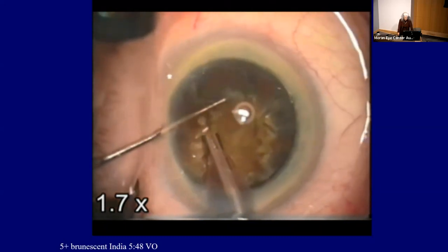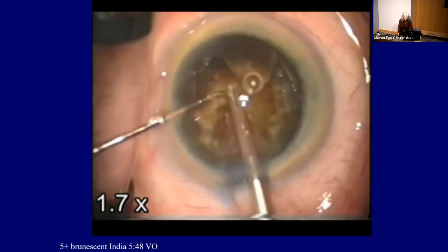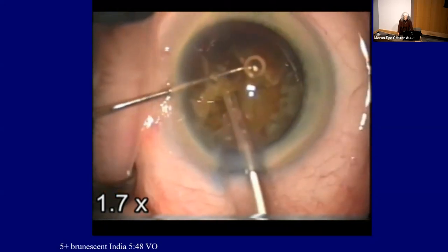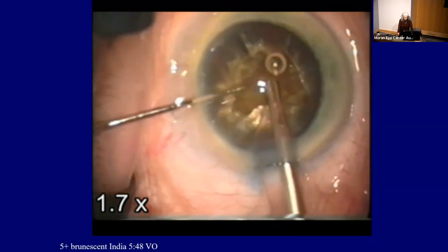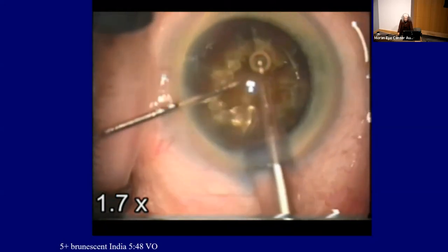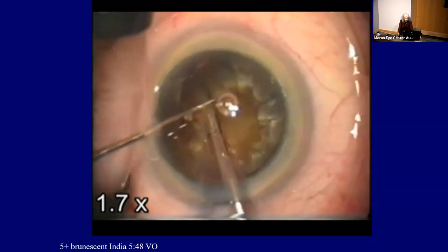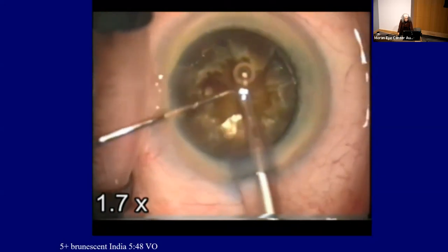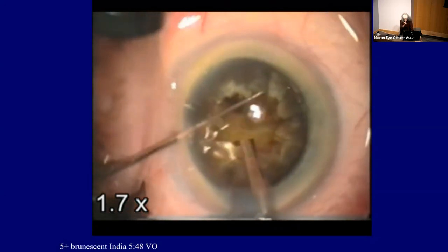You'll see that I won't even allow the whole piece of epinucleus to come. I'm going to hold that back because I want it to be the shoe tree in my shoe throughout this case. And you can see how unaffected the bubble is on the endothelium, and how happy my techs were; they couldn't tell the difference between a 20/50 cataract and a super brunescent on day one post-op for this reason of protection.